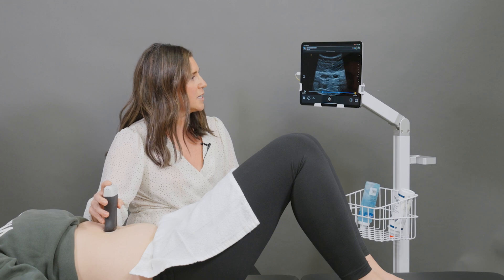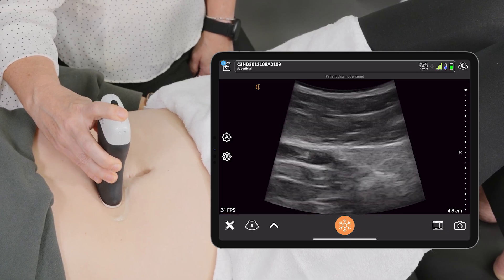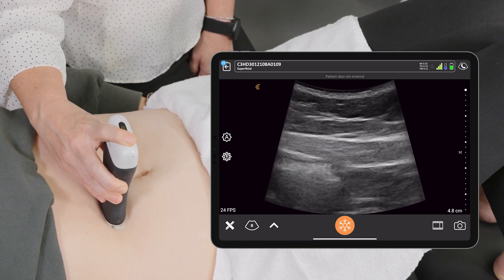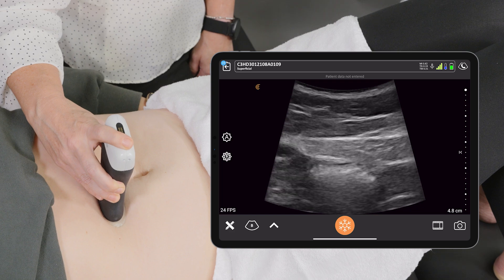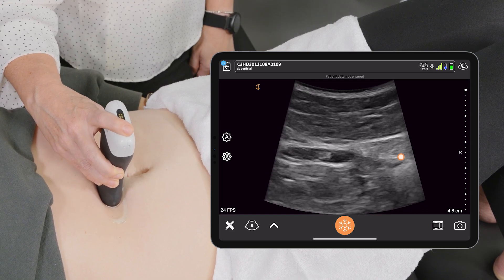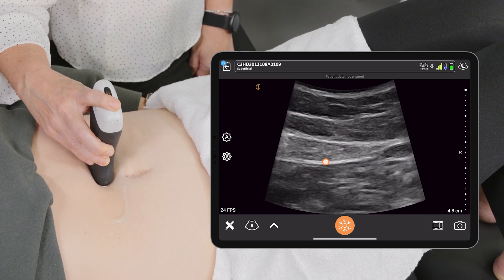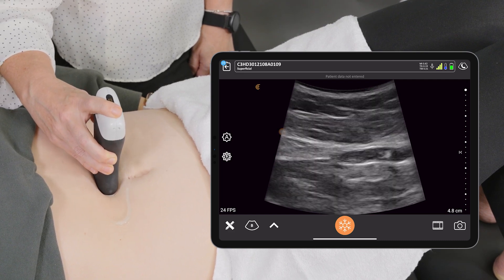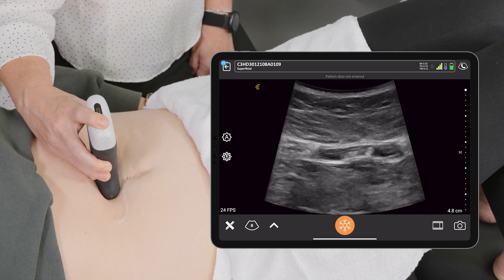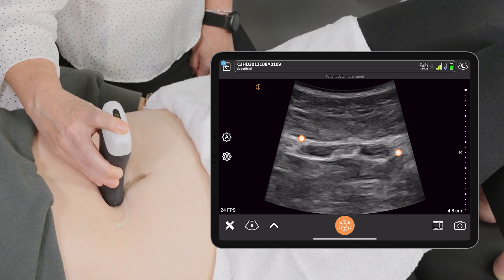I'm going to unfreeze the image, and we're basically looking at finding the head of the rectus. I'm moving the probe over to the right of the patient, then coming through the middle, and I can see the head of the rectus show up here. Then moving through to the left and seeing the left rectus abdominis there. I'm going to come back to the midline so that I can get both of those recti heads in view and get a clear image of that linea alba.